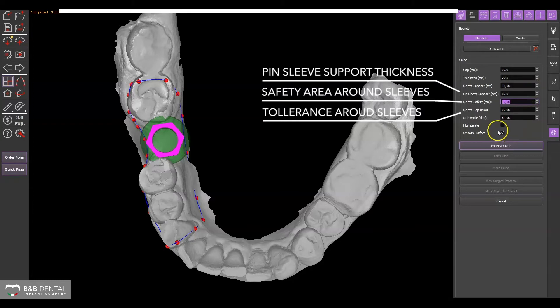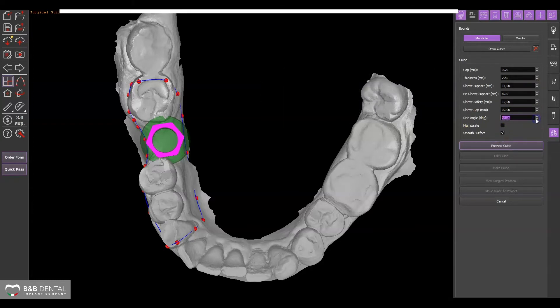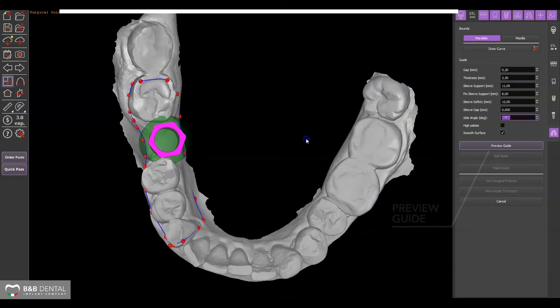Before selecting preview, adjust the display as the software will calculate the undercuts based on the display position.